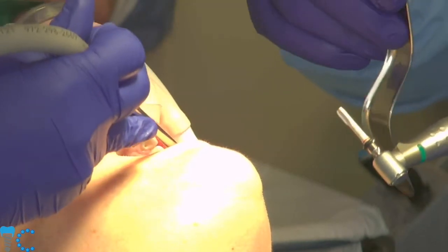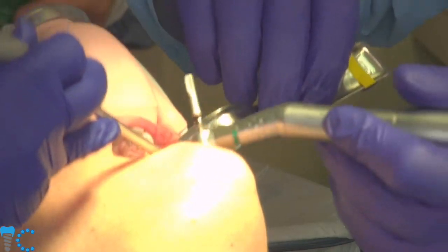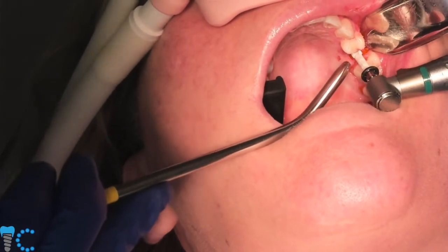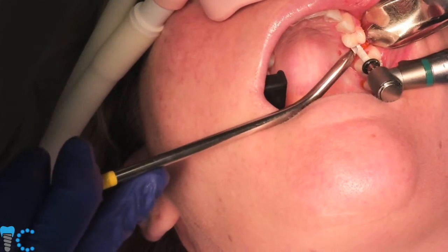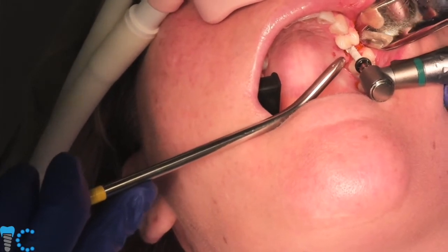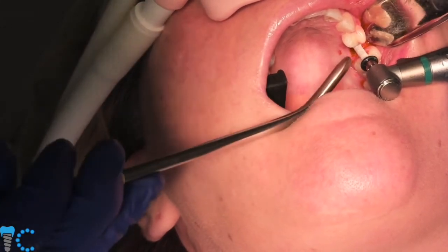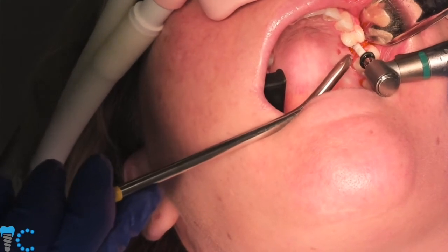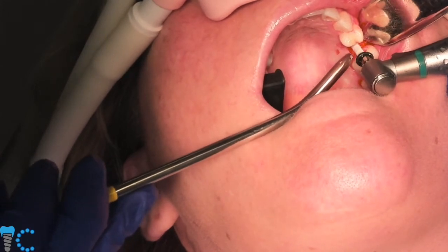So we have our thing down to 20 RPMs. We're going to go to the patient's mouth here. And again, it's a pretty long assembly, but not really a problem here. And now we're going to use a little bit of muscle because this tap likes to walk around just a little bit. Pretty much all taps do. We're going to sink this down close to the bottom of our osteotomy. In this case, we're probably going to take it all the way. Typically, we'll send the tap down about 3/4 of the way.